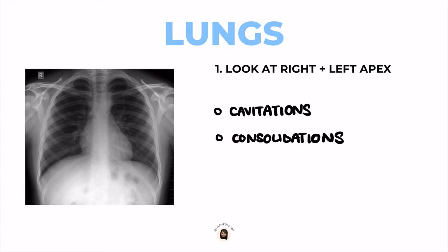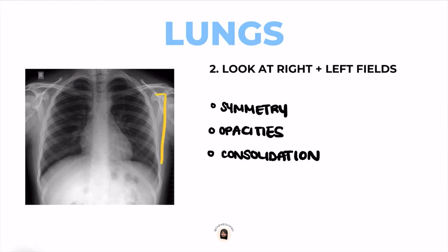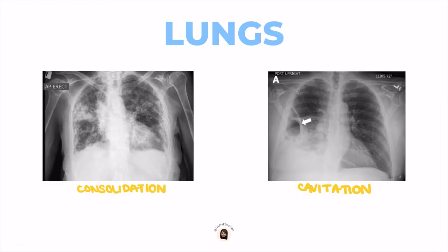Now let's move on to the lungs. We'll analyze from the top to the bottom so we don't miss any parts. Start with the apex — check the right and left apex for any cavitation in the case of TB, or consolidation, which is essentially fluid. Then move on to the lung fields: check for symmetry, any opacities, or consolidation. Consolidation is fluid within the lungs — whether that's blood, pus, or inflammatory material — it shows up as whitish areas on the x-ray.